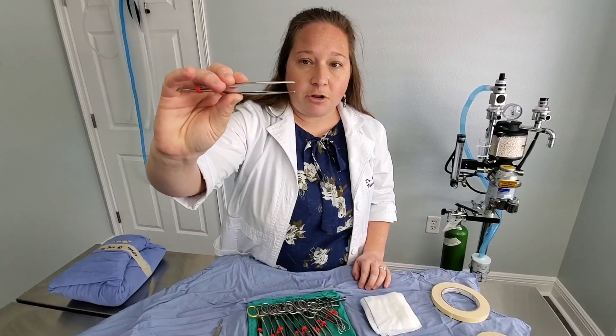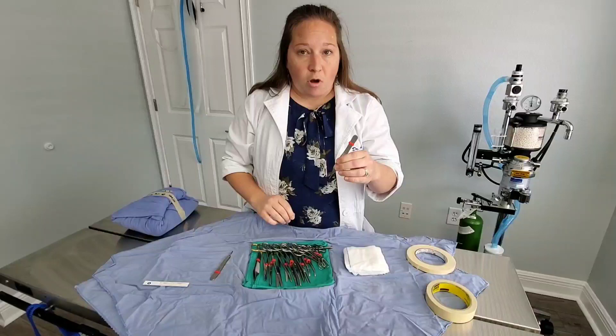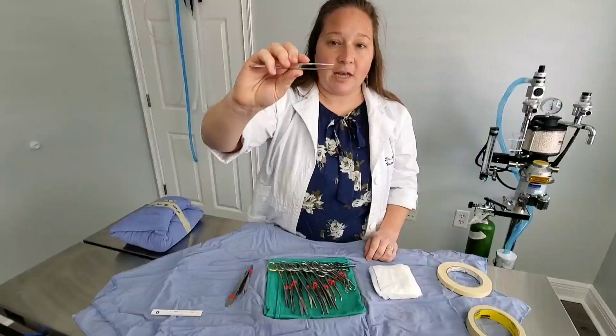We have two different kinds of forceps. This one is called a rat tooth forcep — if you look really closely, there are two little tiny teeth on the tip. This helps me grab things and hold on really well. If I'm going into a body wall for a spay or an exploratory surgery like a foreign body removal, this really lifts the body wall so I can puncture it with my blade.